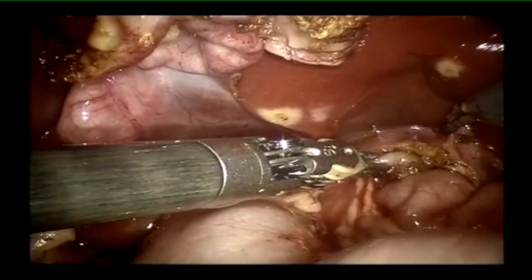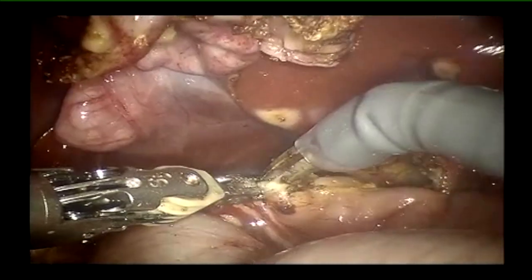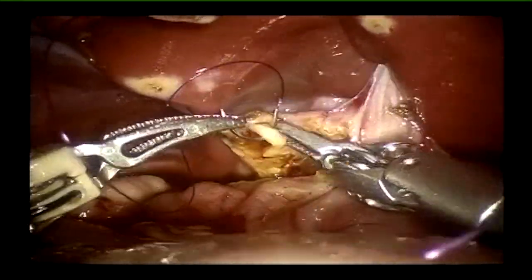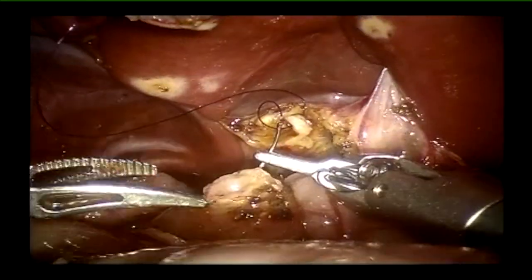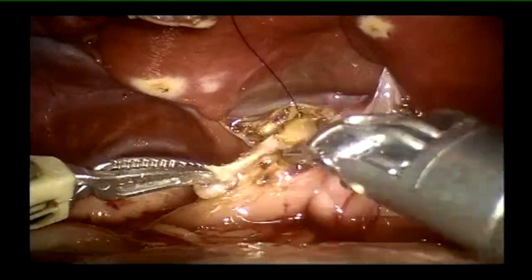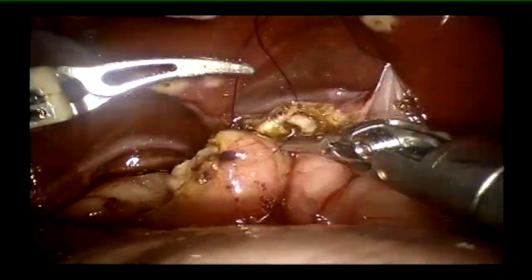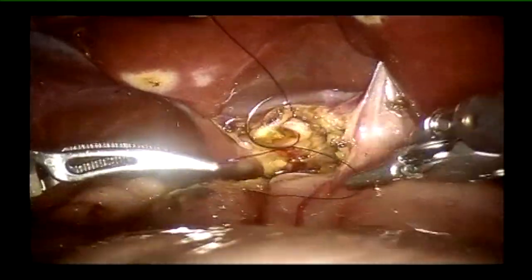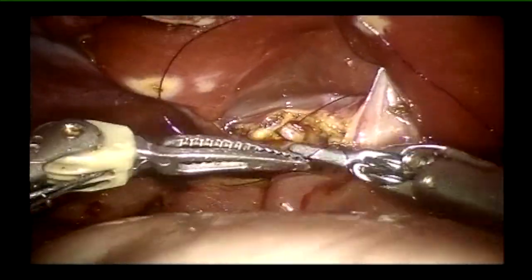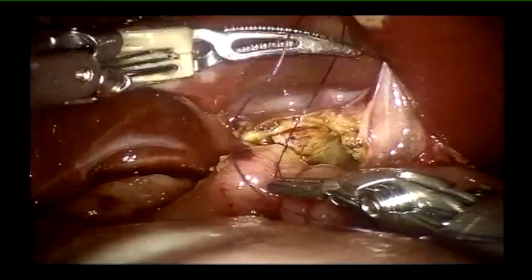We prefer to perform a hepaticoduodenostomy — we've been doing this for close to a decade, both laparoscopically and robotically, with good results. It retains more normal anatomy, allows endoscopic access to the biliary system and liver later in life if required, and is anatomically less complex. There has been much discussion about hepaticoduodenostomy versus hepaticojejunostomy — I feel it's each surgeon's choice. Our justification is that it is a single anastomosis, does not change the intestinal anatomical structure significantly, and has worked well for us.